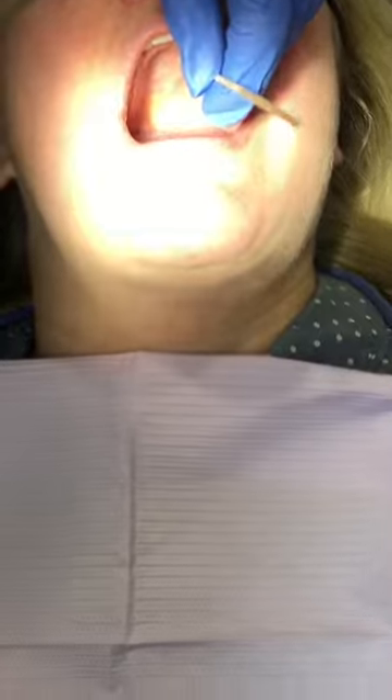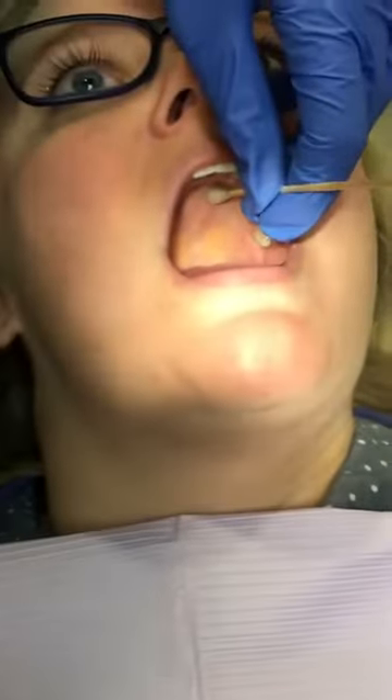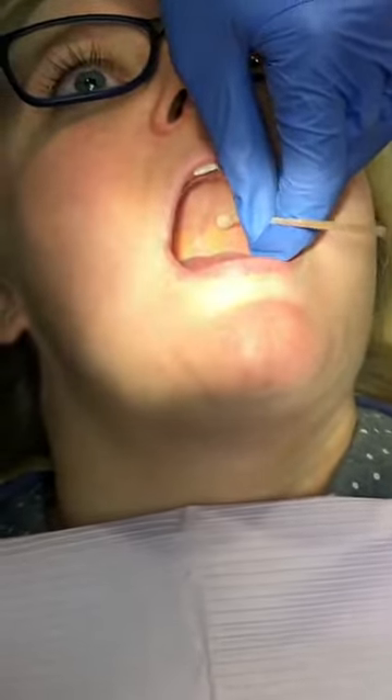We're going to be doing the GP — the greater palatine injection — for both the greater palatine and the nasopalatine injections. We're going to be using pressure anesthesia rather than topical. To demonstrate how to find it, you're going to start with your cotton tip about here.